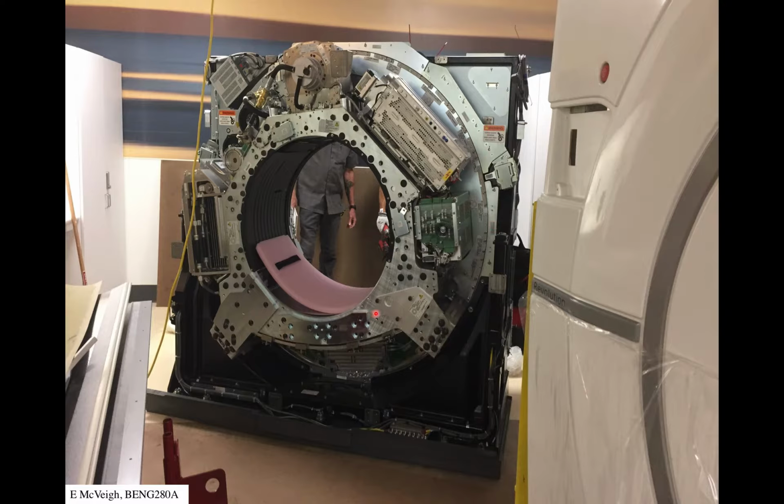This was ours. We got this delivered about two and a half, three years ago, something like that. And so here's the gantry. It's just like watching the techs, the field engineers, put this together. It's just like IKEA on steroids, right? I mean, they have these huge volume books, and they have to bring out these parts and clamp them together to within certain tolerances and things like that. So it's actually amazing that they can mass produce these things and have them installed and they all work, because the mechanics of this thing is pretty impressive.